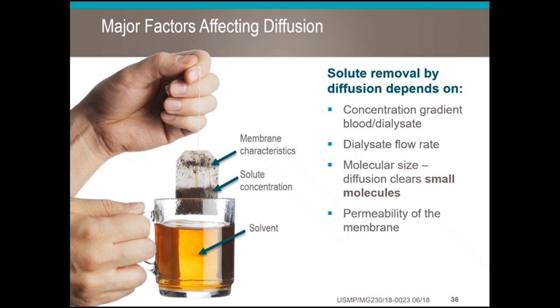But once I get my next renal panel, I'm checking my patient's labs, and I note that their potassium is, for example, 4. I need to notify my physician so that I can get an order for him or her to change the bag of dialysate to a 4K bag. Because if I leave a 0K or a 2K bag hanging, then it will continue to diffuse the potassium out of my patient's bloodstream until it equalizes, and I can make my patient hypokalemic.